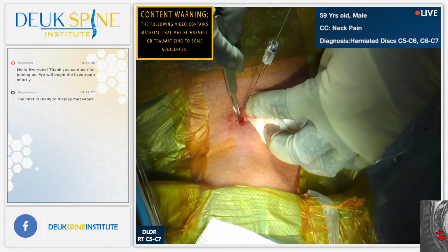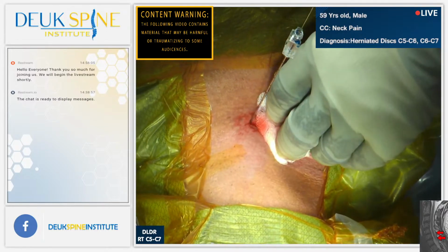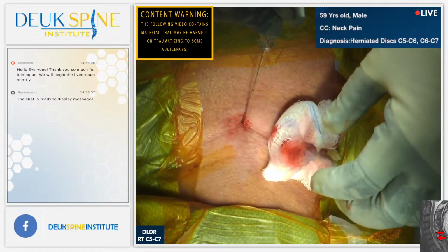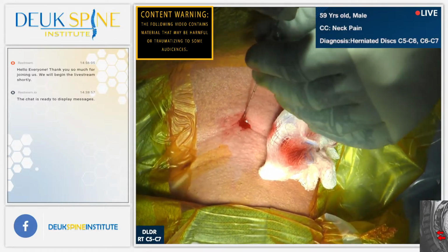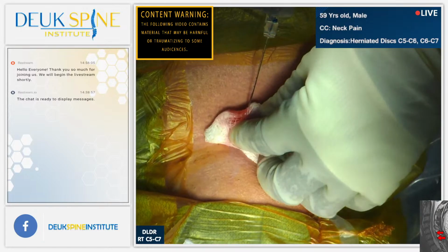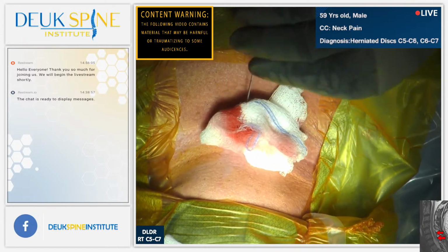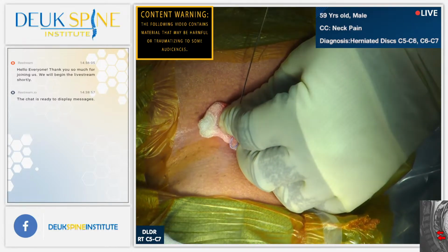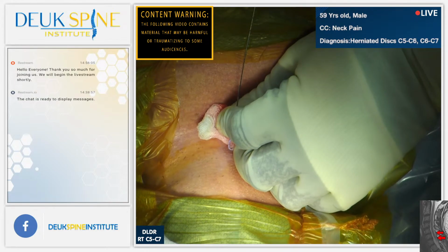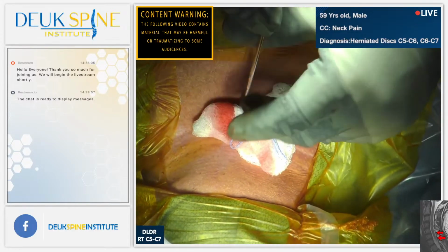Our patient clearly, to me, appears to be on some kind of blood thinner. Something is thinning his blood. It's not terrible, but there's definitely, it looks like, some residual effects. All right, shot. Very nice. You guys are doing great. I think we're okay to proceed. It's minimal. It's not under pressure. It's just a little bit of capillary ooze, we call it. Capillary ooze is not a problem. Stops with a little bit of pressure. Hold on.